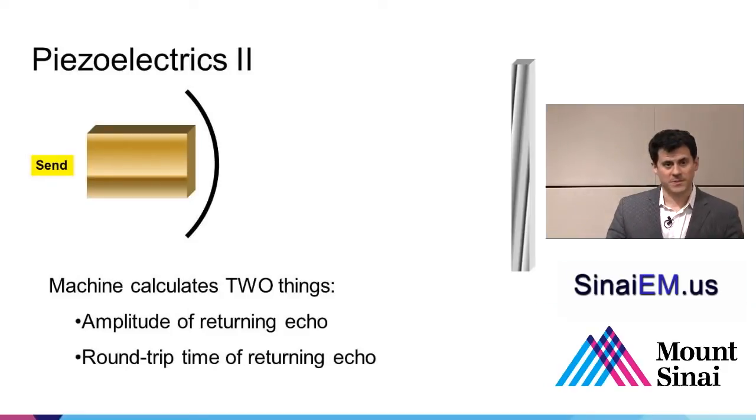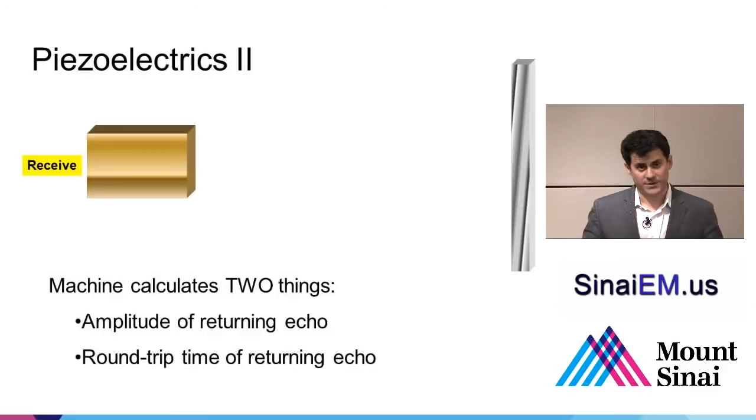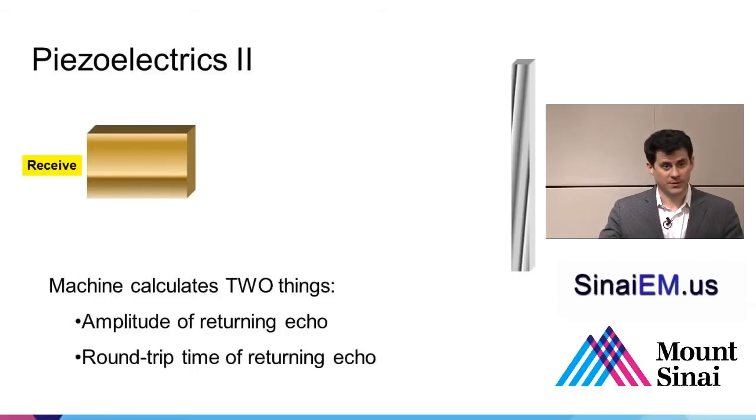So the crystal actually spends most of its time listening. It sends out a brief pulse, which reflects off of a reflector inside the body, and a reflector in the body is anything with a different density than what you started with. So if you start off with the gel and liquid water density of the transducer and the gel that's placed on the patient's skin, and you go through skin and soft tissue which are relatively water dense, when you start to hit organs or bone or air, that change in density causes a lot of reflection back.